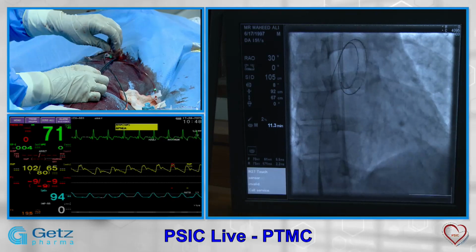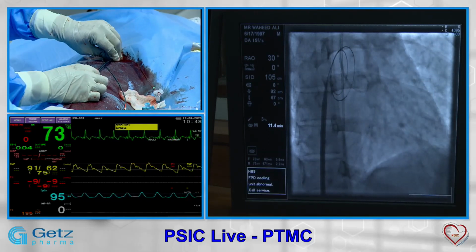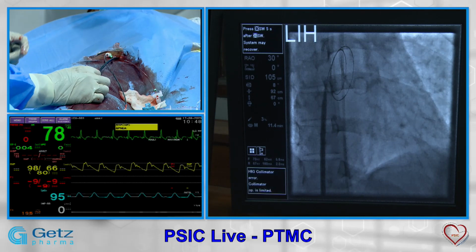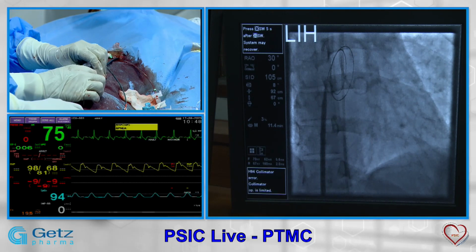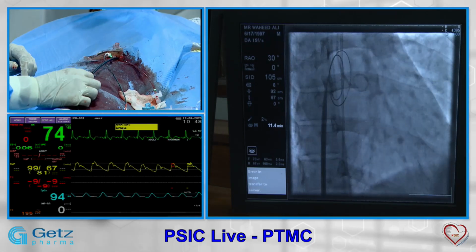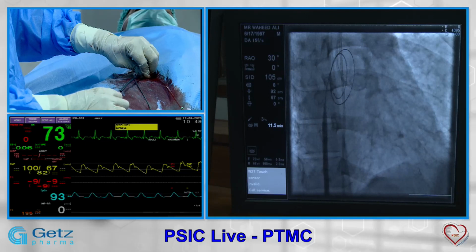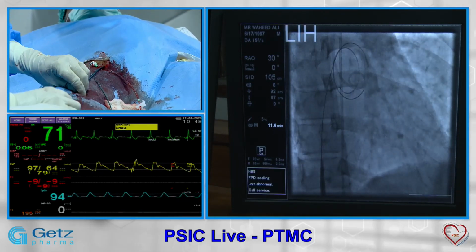Usually what we do is try to dilate the septum and feel the septum, if you can, because in rheumatic fever you can have a thickened septum and you may have resistance on the septum. So you try to dilate it until you don't get any resistance. You can see my hands, and on this one you need to hold your wire, bring the dilator down and then take it forward. In this way, you will not lose your position.